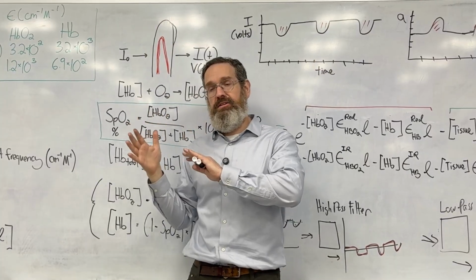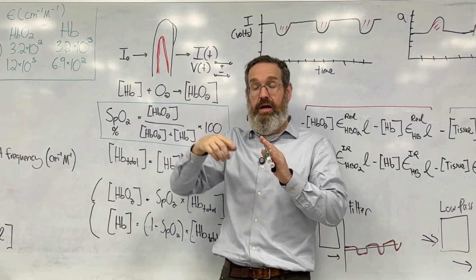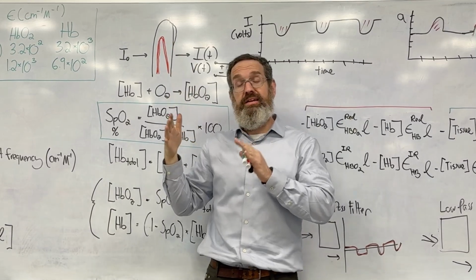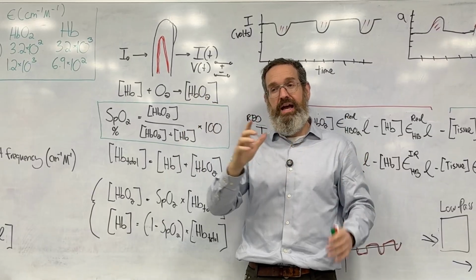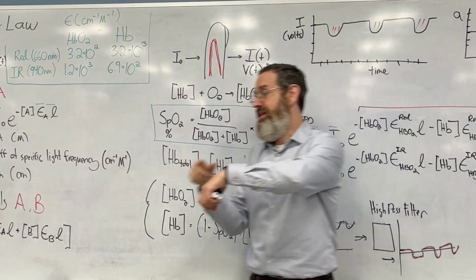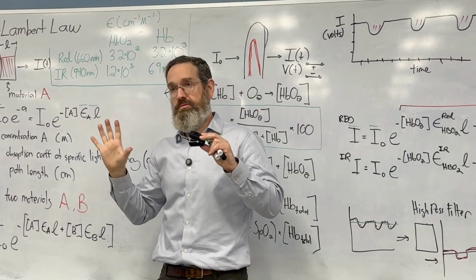In last class, I talked about using a carrier to get rid of it. And that carrier, let's say these lights are flashing at 60 hertz, I'll make that carrier 1000 hertz. So I can clearly distinguish the carrier from what's going on. And I also mentioned, in passing, that these things don't use sinusoids, they use pulses, all right?